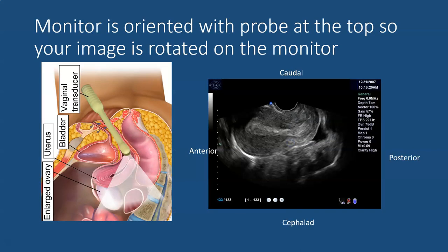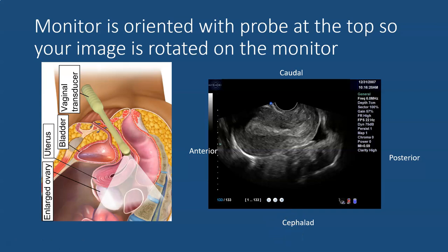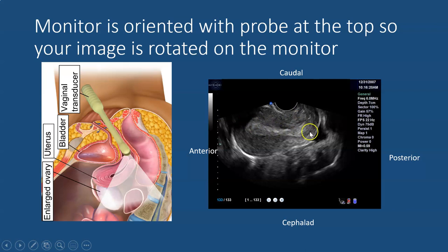On our monitor, the monitor is oriented such that the probe is at the top of the screen, so our image is going to be rotated. The top of the screen is where the probe is placed — this is the caudal end. The area away from the probe will be the cephalad or towards the patient's head. The indicator is directed anteriorly such that the indicator on the monitor screen will be the patient's anterior aspect and the area away will be posterior. Here one can see the long axis or sagittal view of the uterus with a small amount of fluid in the cul-de-sac.